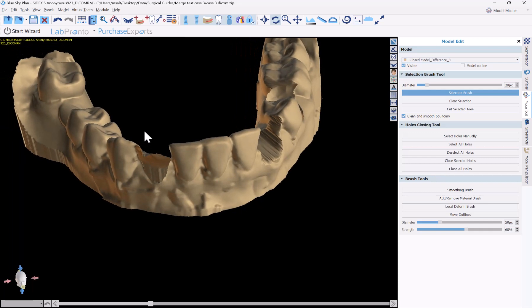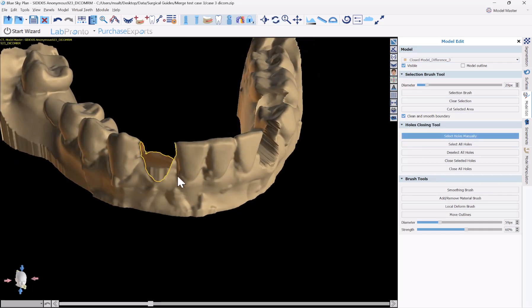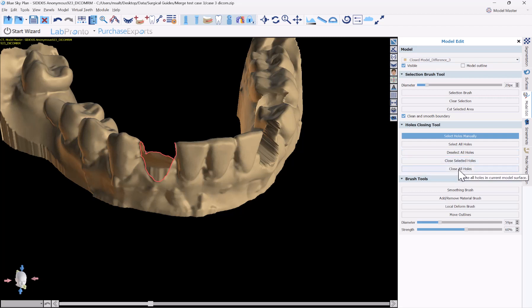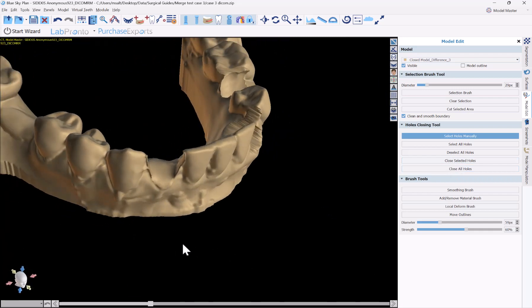After extraction we have a big hole. We can click select holes manually and left-click on the hole to select it. Since we only have one hole, we could also click select all holes. Then click close selected holes or close all holes. Let's click close selected holes — and now we've closed that hole.